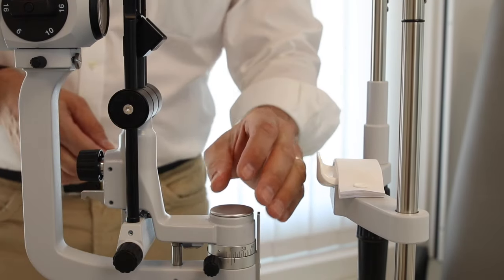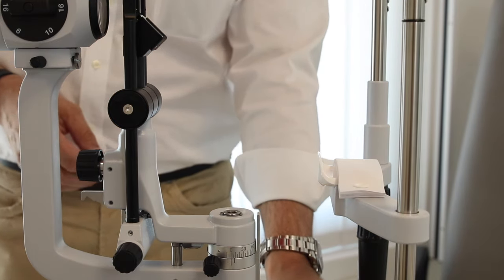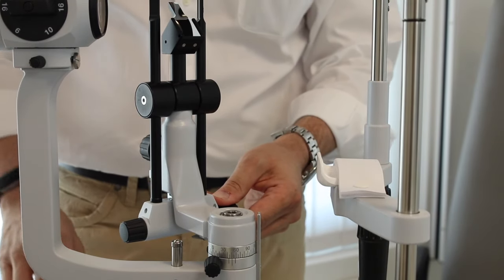This is a CI device on a slit lamp. In the first step we take off this metal protector, then we create a little bit more space.